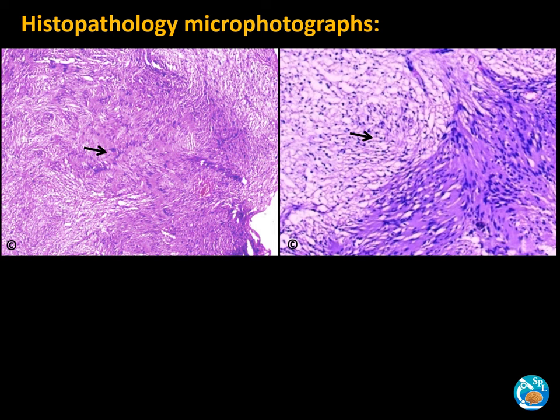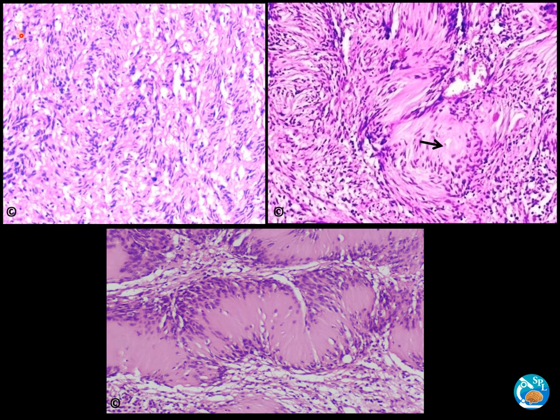Coming to histopathology of case one, the tumor showed two basic architectural patterns in varying proportion: the typical Antoni A areas, which are composed of compact elongated spindle cells with nuclear palisades, and a lesser cellular Antoni B area composed of loose architecture with indistinct cytoplasmic processes and variable lipidization. You can see here a striking nuclear palisade formed from stacked arrays of nuclei with alternating anucleate zones.